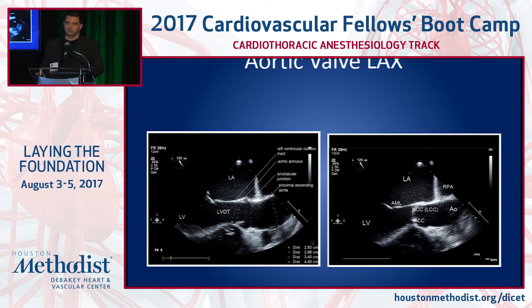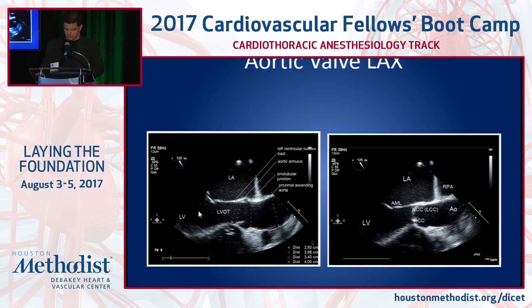Long axis view, same thing, aortic valve, normal images. A bunch of things that you're going to see on each one: the leaflets, the LVOT, sinus of Valsalva, sinotubular junction, ascending aorta, right ventricle somewhere down here, and then mitral valve — a little bit of mitral valve — left atrium and left ventricle down here.